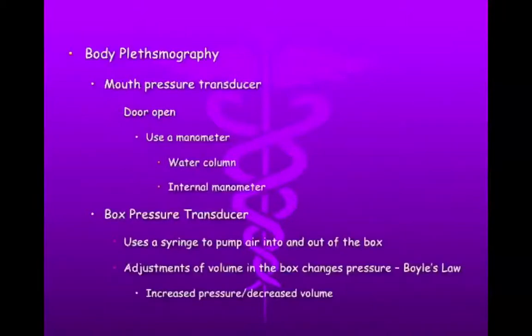Body plethysmography, we use a lot of pressure. And we look at the pressures when the door is open, the pressures when the door is closed. There's manometers that you got to do. You have to know what the barometric pressure is. You have to know what the box pressure transducer is. When we go to Colby to play with their machine, as it's calibrating, reach and push on the glass. It'll throw the entire calibration out of whack because you just increased the pressure on the glass on the outside of the box, and it changes everything when you do that. That's kind of an interesting little thing. You can see it immediately occur.